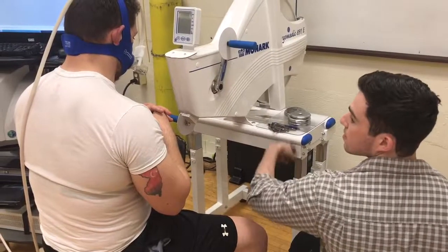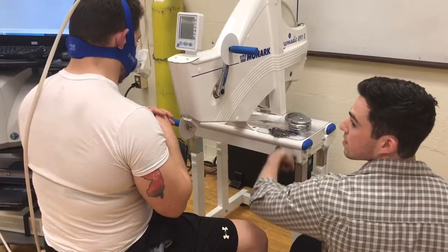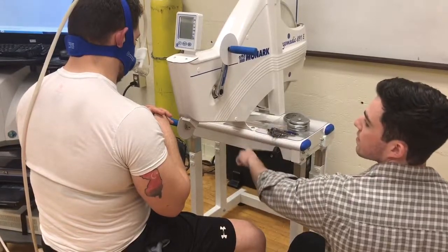Before beginning an upper body Wingate, you have to adjust the arm cycle's height so that the axis of the wheel is aligned with the subject's shoulder joint.